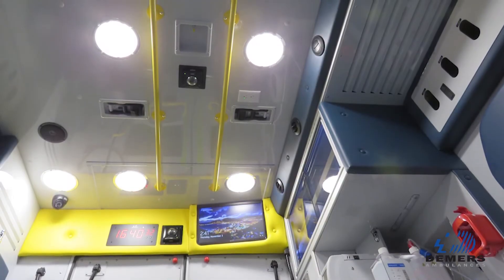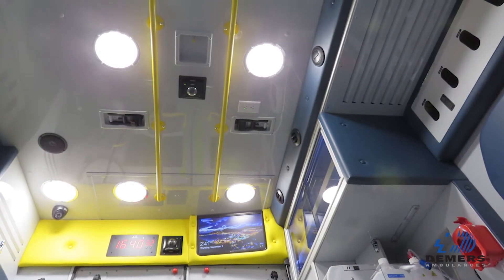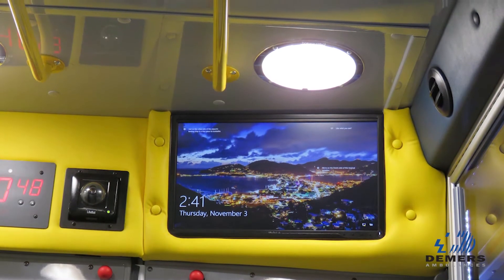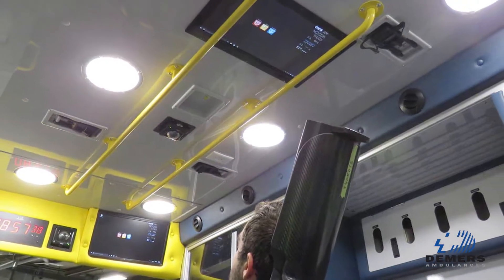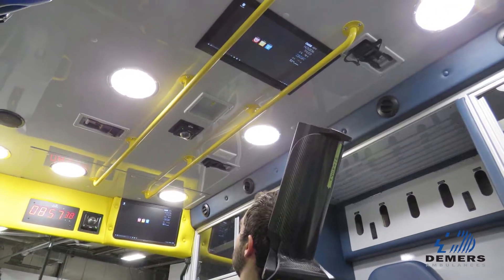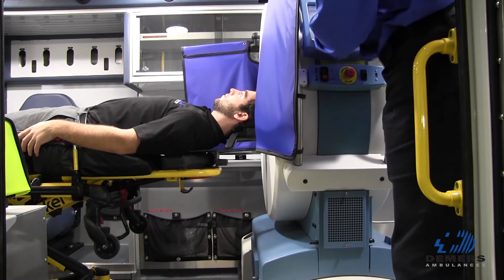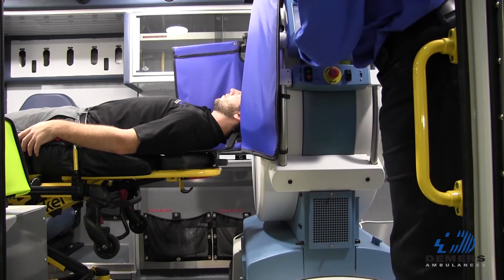One of the requirements for the telemedicine system was that all of the equipment be as recessed as possible in the ambulance. So we've added two screens and two cameras, positioned with the help of the customer so that they're not in the way of the crews that are working around the patient.